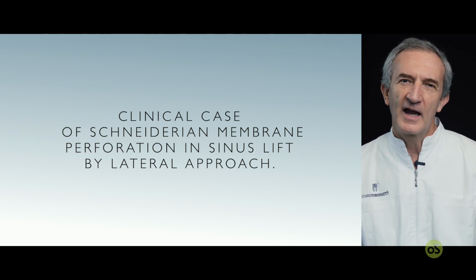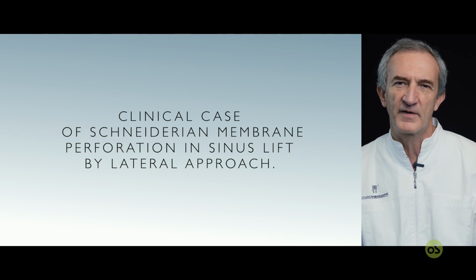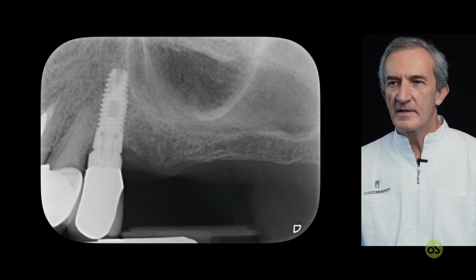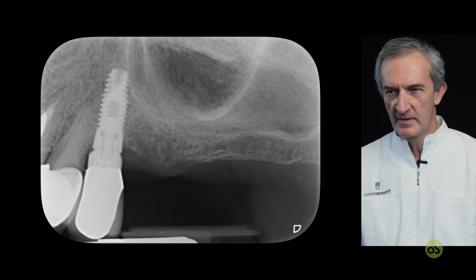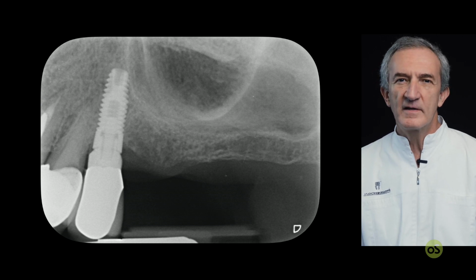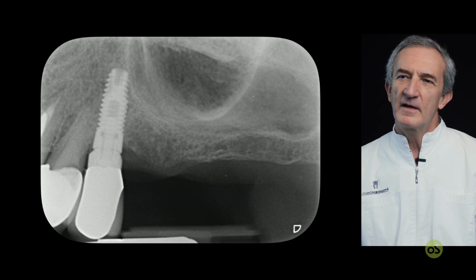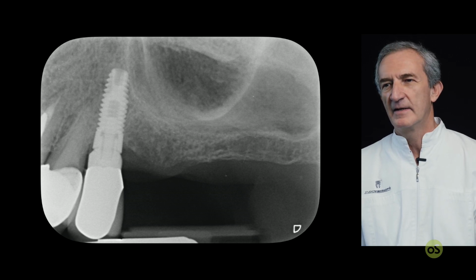And today, I'd like to introduce you a case in which I had a laceration just in this phase. The clinical case that I'm introducing now is of a patient who came to my office 5 years ago. She lost the upper premolars many years before, and a colleague of mine installed one implant in the premolar area, in the second premolar area.